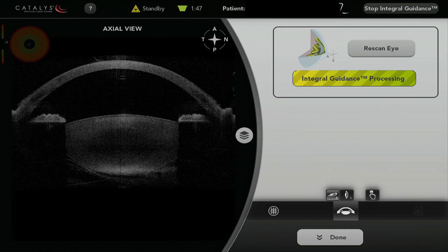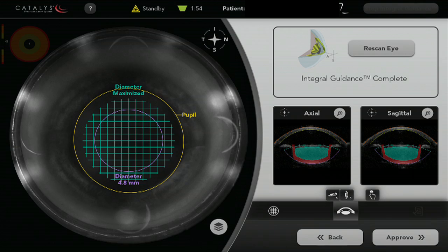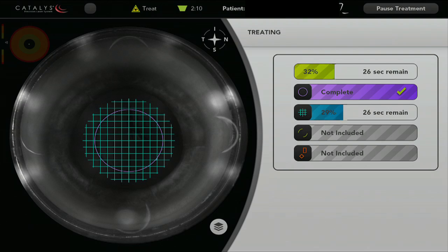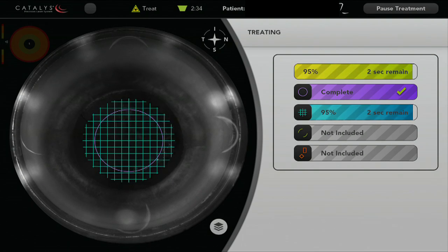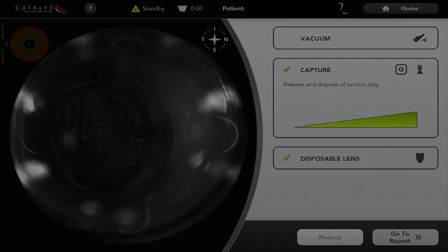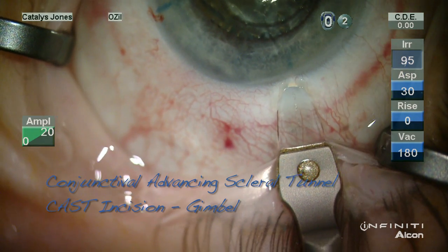Here we're imaging the structures in the front of the eye using the Catalyst femtosecond laser system, and you can see the surface fits and safety and treatment zones. The capsulotomy in this upgraded software is applied in less than two seconds, and then the lens material is softened at a 500 micron grid spacing. The lower pressure system of this femtosecond laser provides an added measure of safety in terms of incisional integrity, given the history of radial keratotomy.